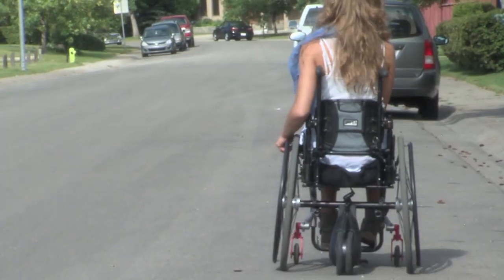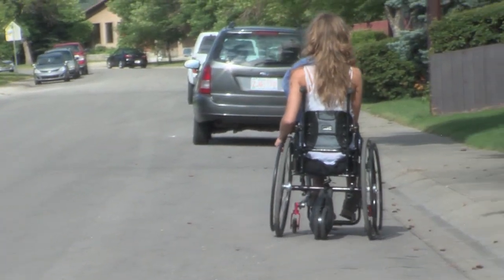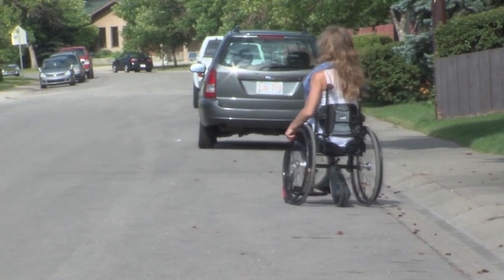So with the SmartDrive, with the push of a button I don't have to push — I just have to control the steering of my wheelchair and the SmartDrive does all the pushing for me.